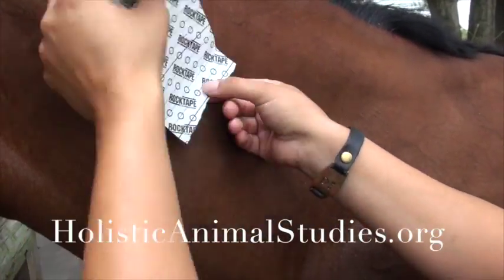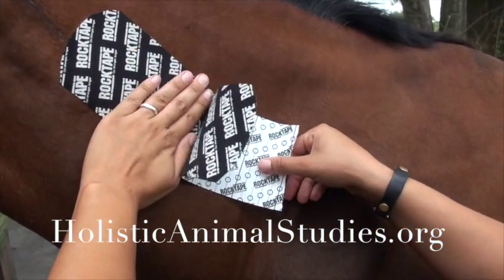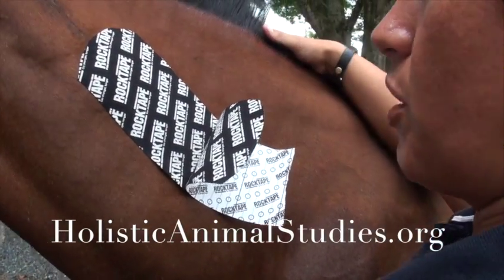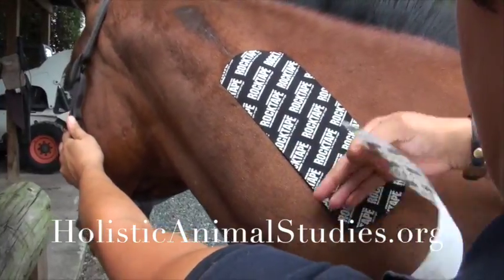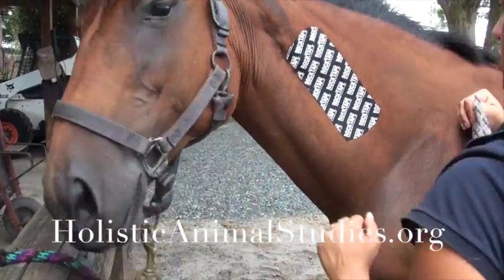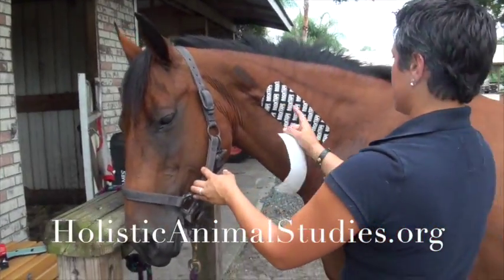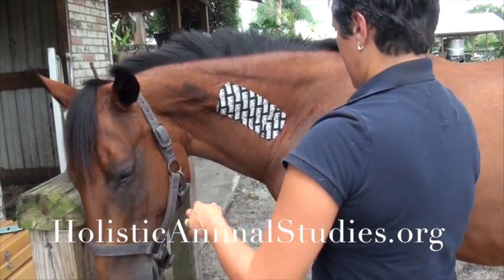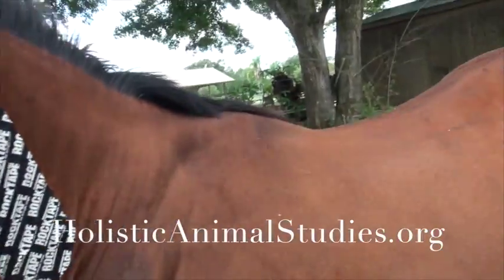Then I'm just going to pull this paper off and lay the rest of the tape down with paper-off tension. Another thing we can do on the neck is bend the head away from us and lay it down paper-off tension — that ensures she has full range of motion and puts a little extra stretch into it. And when she pulls her head back, we get a few convolutions — some wrinkles. That's a good thing; it helps lift the skin and decompress it a little bit more.